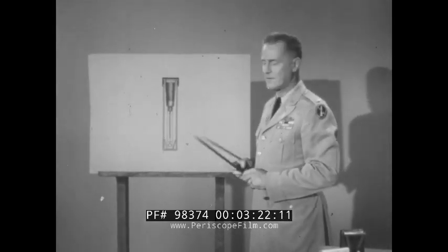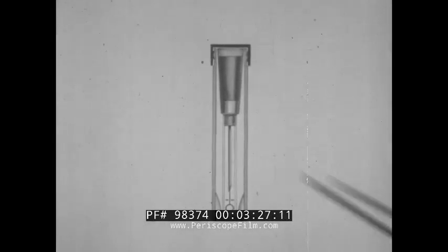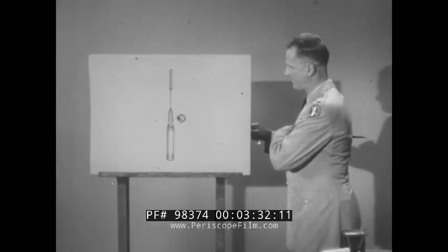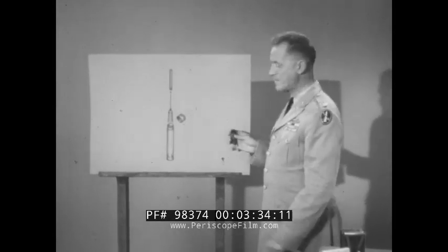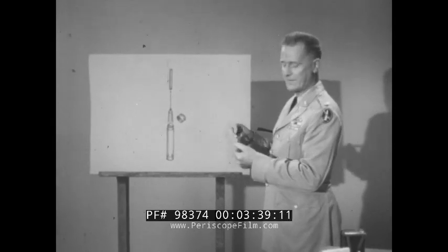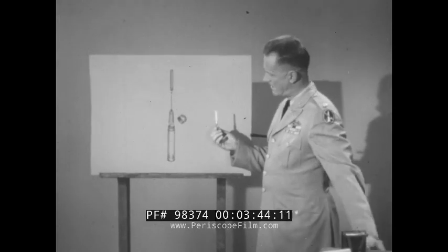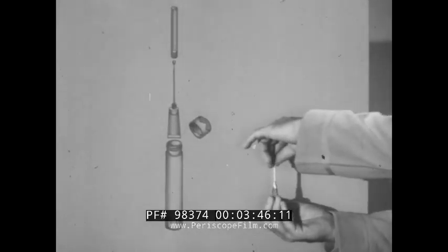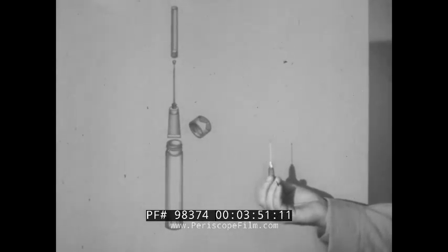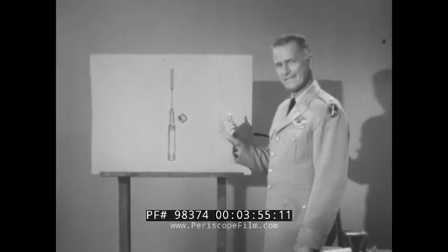Here's an enlarged drawing of the syrette and the plastic container it comes in. The cap is removed, and out comes the syrette. The plastic needle cover is removed like this, by unscrewing. Now, this is just a soft metal tube similar to the one your toothpaste comes in. Let's see how it works.